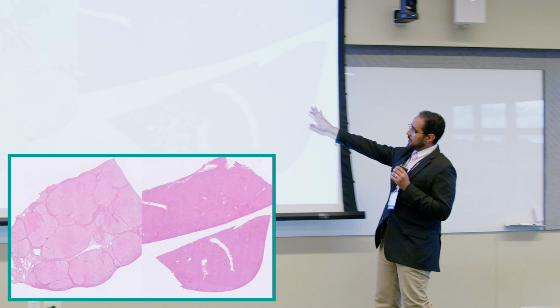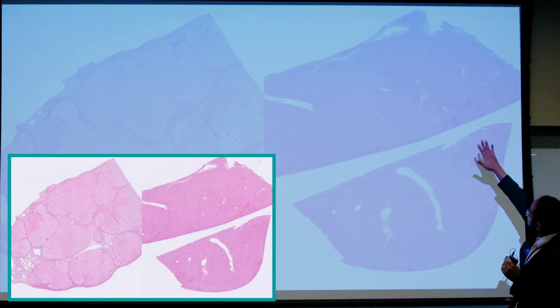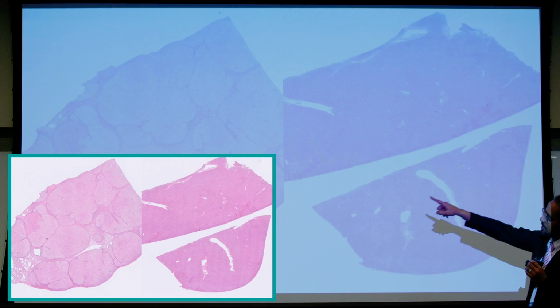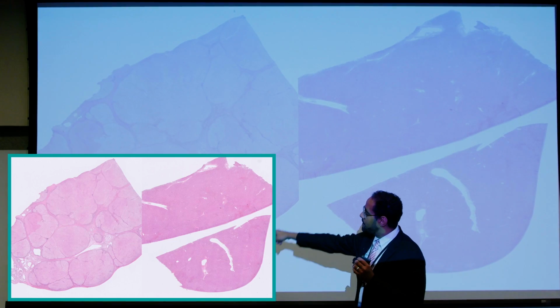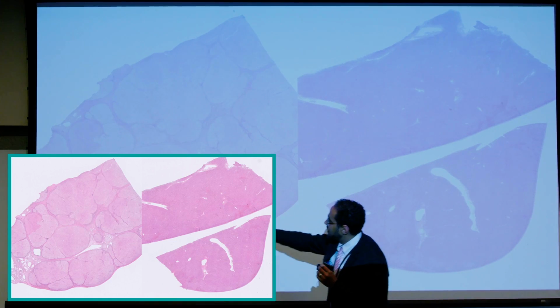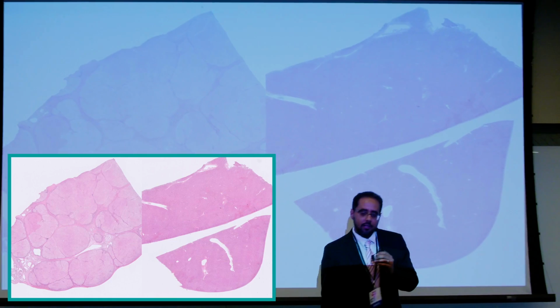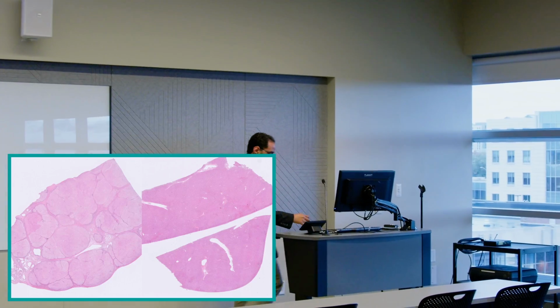So this is your normal liver, very smooth, nice, with good architecture of the liver cells, and this is your cirrhotic liver. You can tell, even if you're not trained in pathology, this is very nodular. It's not how the normal liver should look. This is normal liver, and this is the cirrhosis. So this is the end stage of the process if it was not treated early.